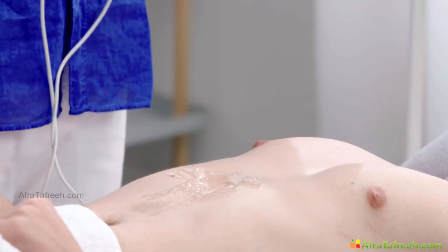Some final tips. If you want to improve your image quality, press the transducer firmly on the chest. You have to indent the transducer at least to some degree because you want to have a good contact with the body. Next, rest your arm on the chest of the patient because there you are more stable. Use enough gel. Use the respiration to your advantage. Sometimes you'll get better image quality if you let the patient inhale, sometimes when he exhales. Try both. But most important, practice. Because only with practice can you get better, and eventually you'll be more confident.